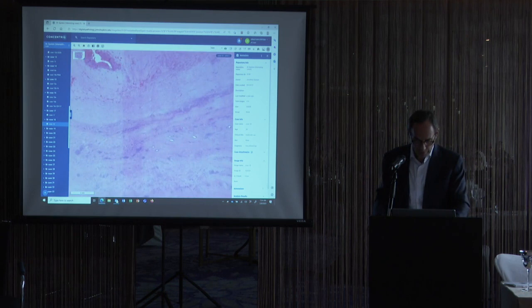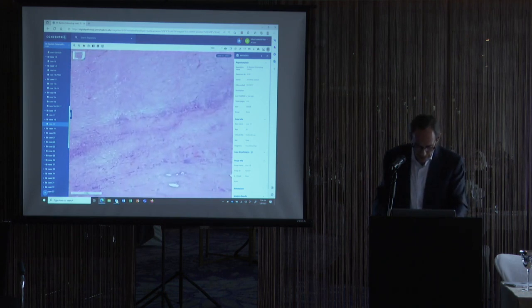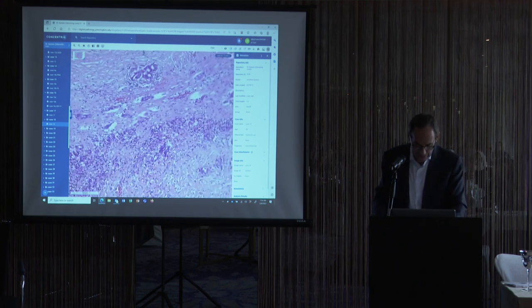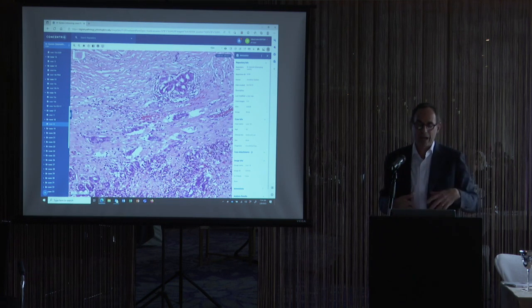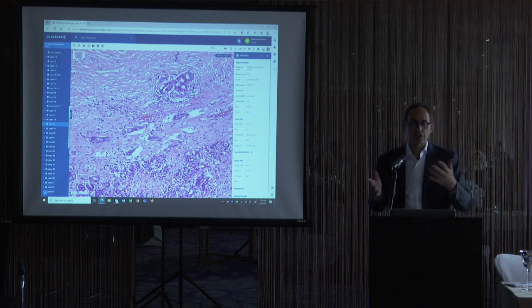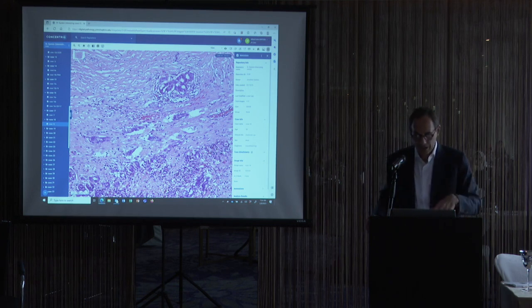Where it becomes an issue for the pathologist is that it's not uncommon in hydrocele sacs to see florid proliferation of mesothelial tubules. And that's very concerning and can be difficult for pathologists to make the distinction, is this benign reactive mesothelial hyperplasia or potentially malignant mesothelioma? Because malignant mesothelioma can cause a hydrocele, and so both can present with a hydrocele, either reactive mesothelial proliferation associated with a hydrocele or malignant mesothelioma causing a hydrocele.